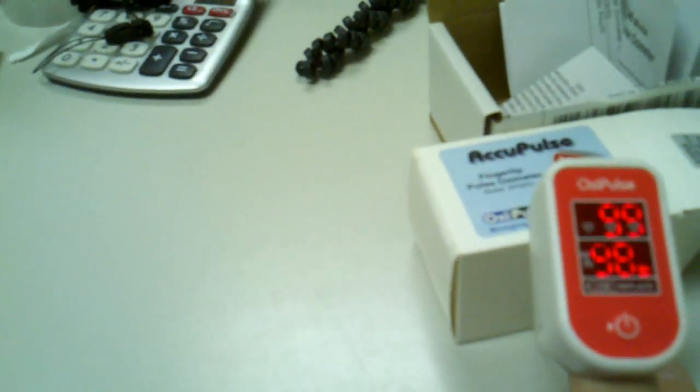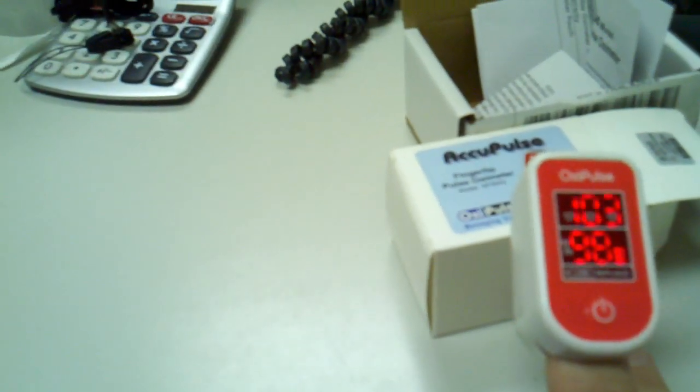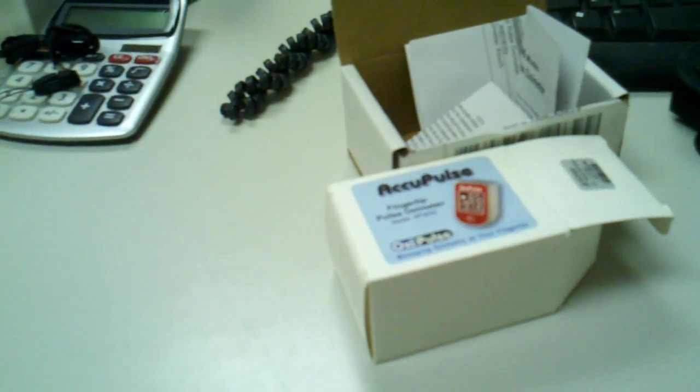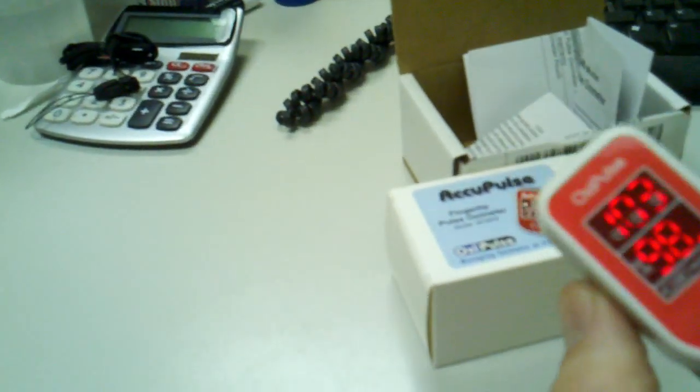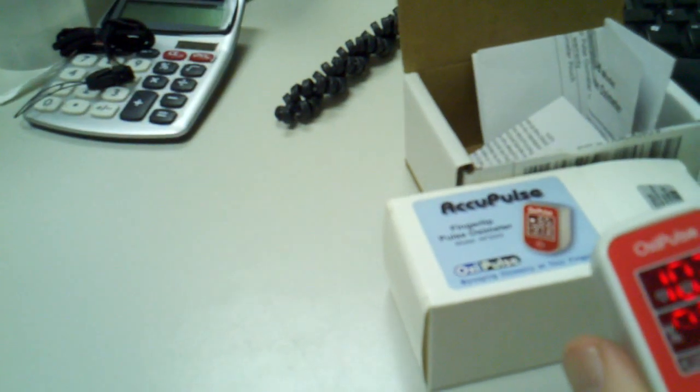Just give it a little time, maybe 10 seconds to 15-20 seconds to be accurate. Then you just remove it and it'll turn off.